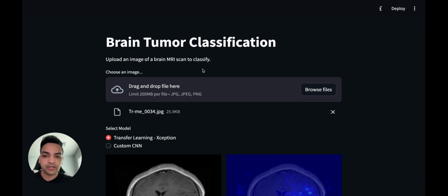With neural networks, the process of analyzing large volumes of MRI scans can also be significantly sped up, and it can reduce the variability in interpretations that might occur between different neurologists or at different times. So in this project, we'll train multiple neural networks on a dataset of 1,000 brain MRI scans, where each MRI scan can be classified as containing either a glioma, meningioma, or pituitary tumor, or not having a tumor at all.